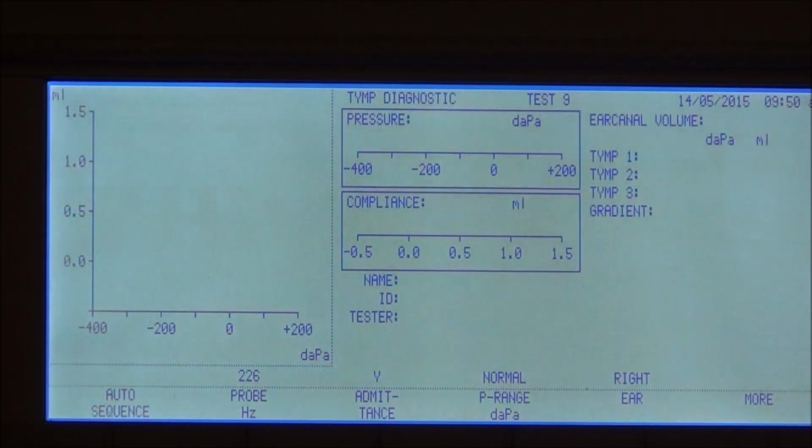It's a graphical representation of compliance. When you say compliance, you should understand what component you are measuring. Stiffness susceptance. You measure only stiffness susceptance, and you consider that as the total admittance, because the rest of the components make a negligible contribution.